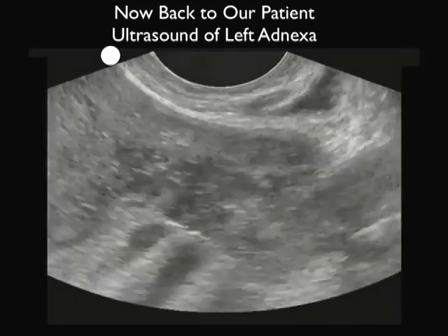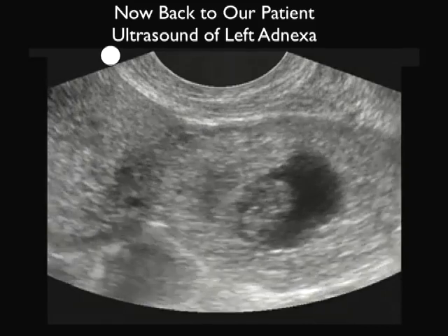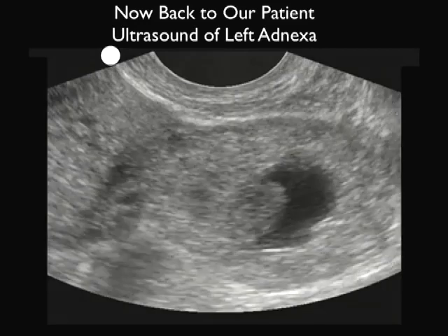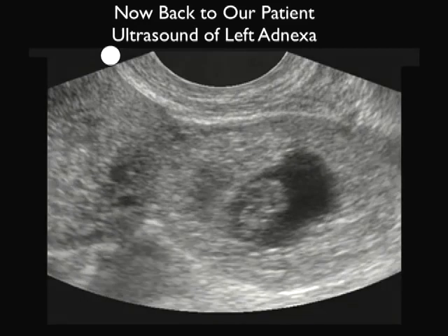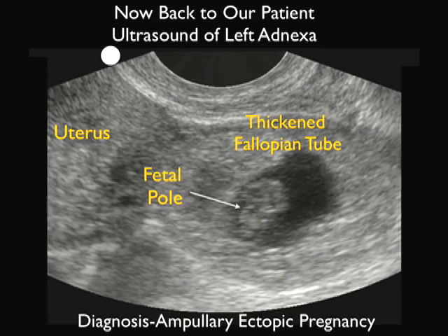And we see here a thickened fallopian tube, or a bagel. And let's look inside the bagel. And what we see there is the presence of a fetal pole. So we'll go ahead and freeze that, and we see again the uterus towards the midline, the thickened fallopian tube out towards the left adnexal region, and within the thickened fallopian tube, the presence of a fetal pole, making the diagnosis of an ampullary ectopic pregnancy. So our next move was to call OB-GYN stat for a consultation.